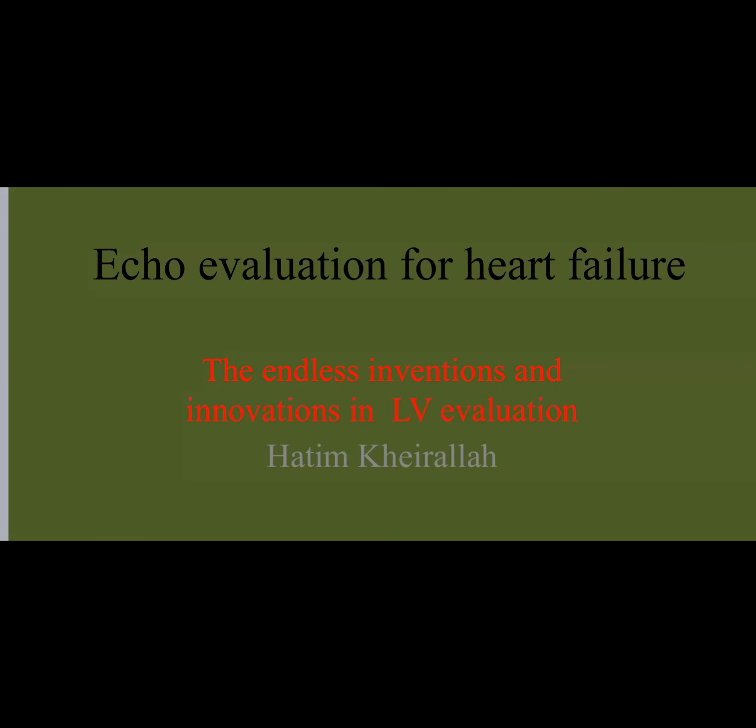Okay, so this presentation is dedicated to the evaluation of LV systolic function by echo.